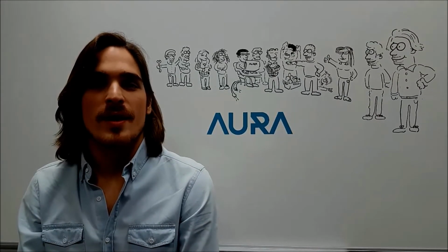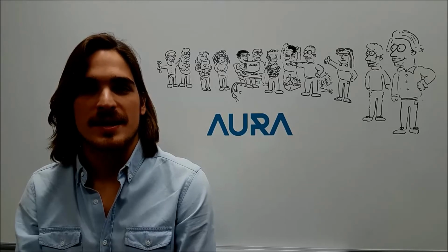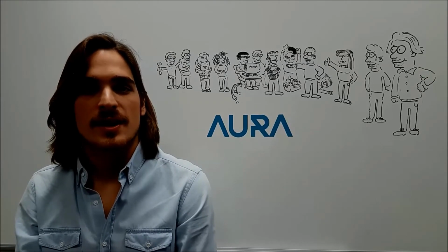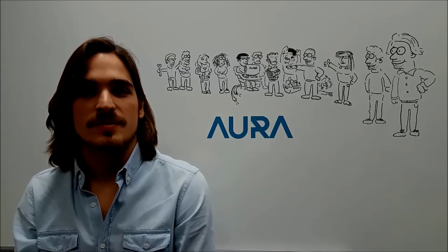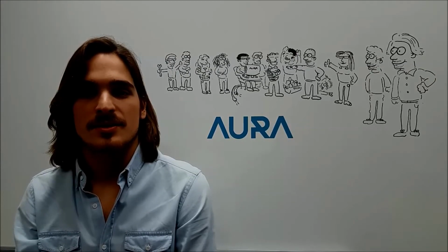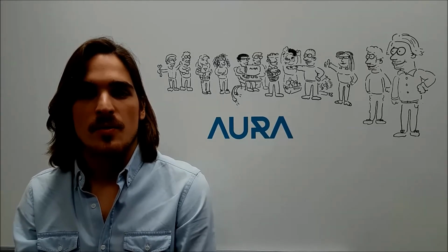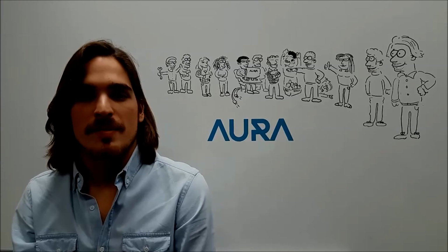Nowadays, there exists no way for physicians to obtain functional data that can aid in the diagnosis or rehabilitation process of patients. ORTE will provide groundbreaking solutions so that the physicians can adapt the treatment to the patient's evolution. Moreover, ORTE will allow physicians to treat more than one patient at a time, increasing productivity and enabling cost savings. At ORTE, we imagine this to be the future of rehabilitation, and today we are making this possible.